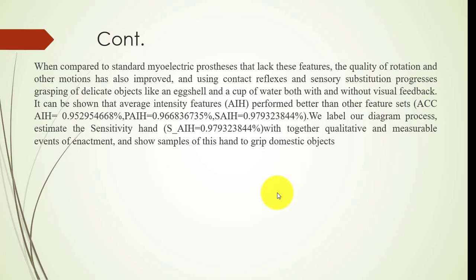Our technique is compared with another technique by sensitivity, which differs, but we achieved 97.9 percent sensitivity, which is good compared with other types, and this hand also shows it can grip domestic objects.